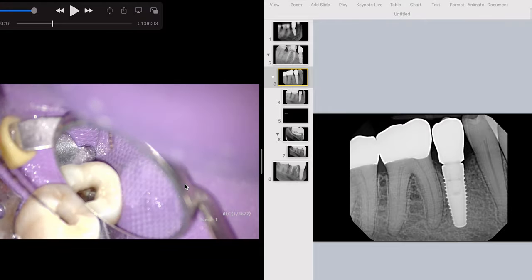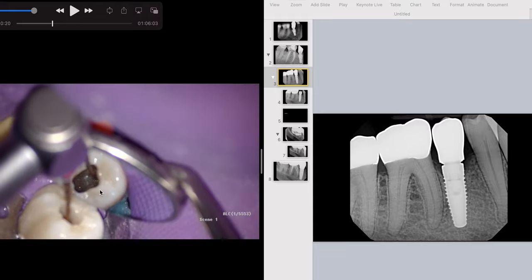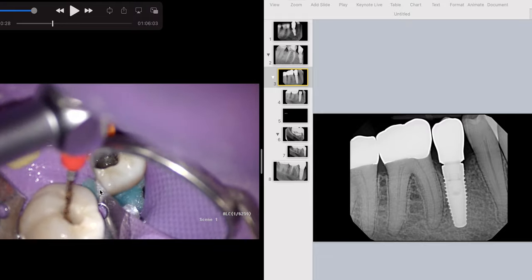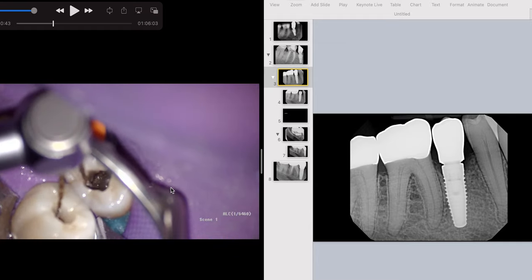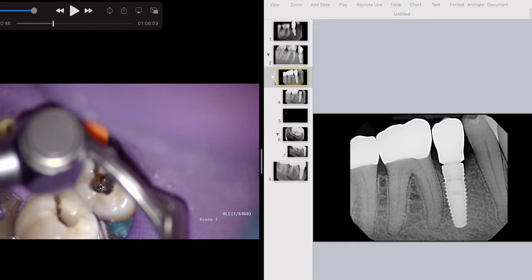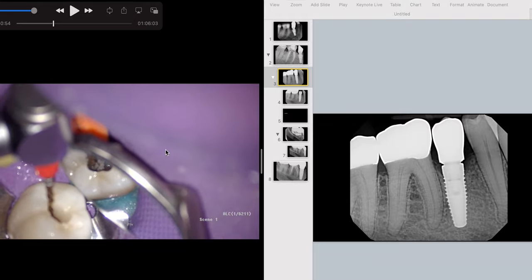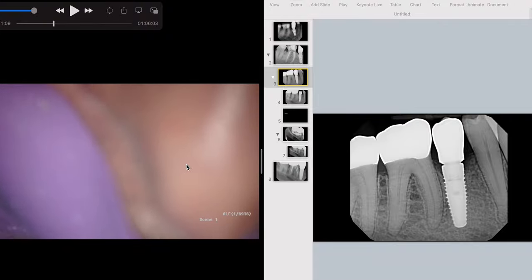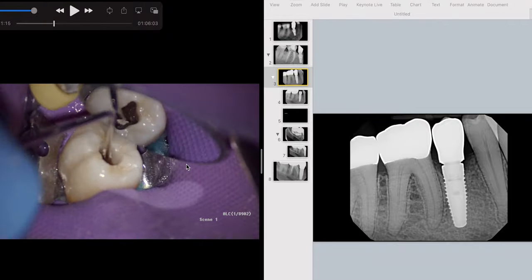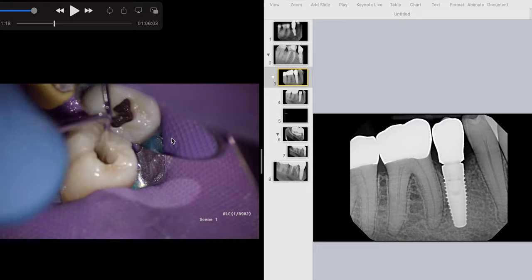Here's a simple tip: I've got my mesial lingual with my Endo Explorer in it. I usually just take my Wave One Gold primary reciprocating file and open up that orifice. I feel confident — I've been doing that for about three to four thousand cases, and it works like gold. My distal — my hand file won't quite go down it, but I give it a shot. And lo and behold, boom, I find it. That is the best feeling — when you've been 20 minutes trying to find orifices and you get in.